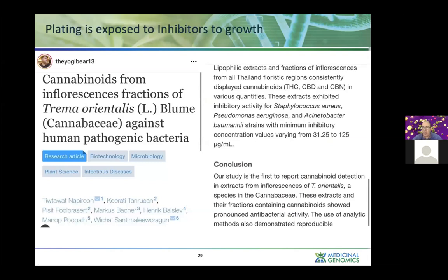Many people will say, oh, there are polymerase inhibitors out there. And that may be true if you're doing a simple boil prep. If you take this sampling and just simply boil it and then put that into PCR, you are exposed to the polymerase inhibitors that might be there, from the terpenes to the cannabinoids. Who knows? There's a lot of things there that could potentially inhibit polymerases. If you're performing a DNA isolation, like we are performing in our methods, all of that stuff gets an ethanol extraction and gets washed away.